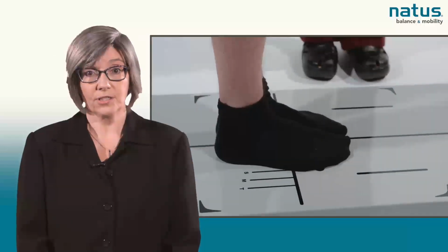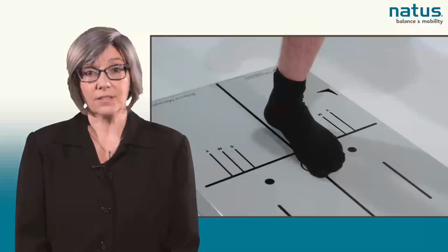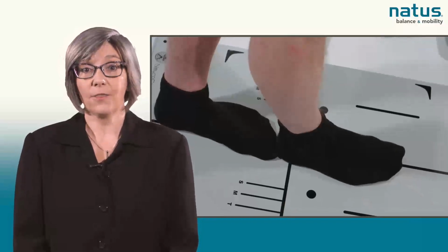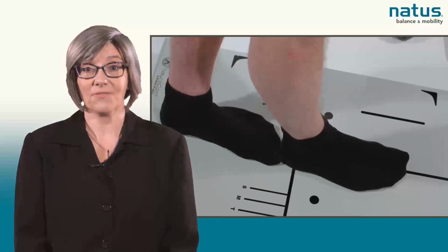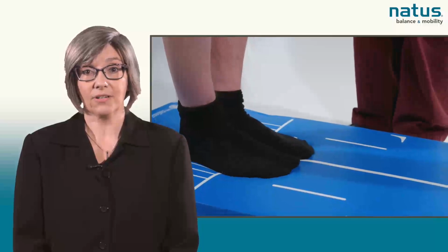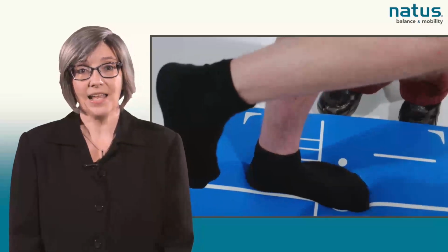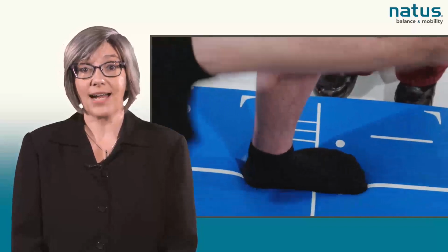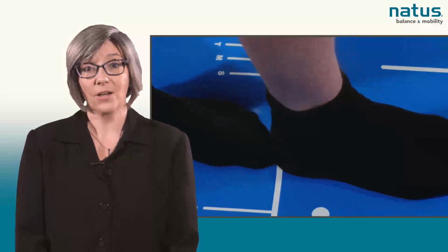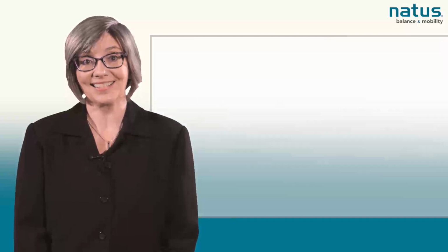The testing conditions utilized by the SET protocol are divided into firm conditions, those performed directly on the force plate, and foam conditions, those performed with a foam pad on top of the force plate. Both conditions test the patient with feet together, in single leg stance, and in tandem stance. Test time is 2 minutes divided into 6 20-second protocols of 1 trial each. With instructions, the total time to complete the test is approximately 5 minutes.